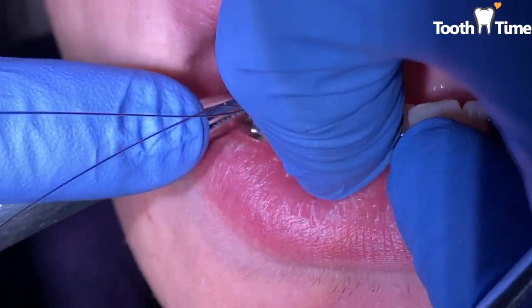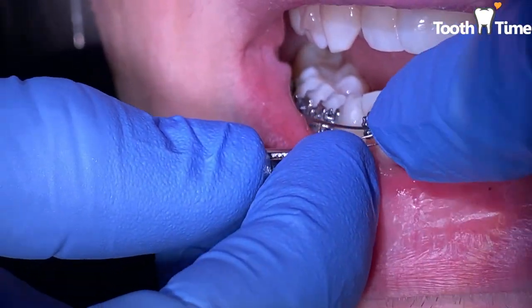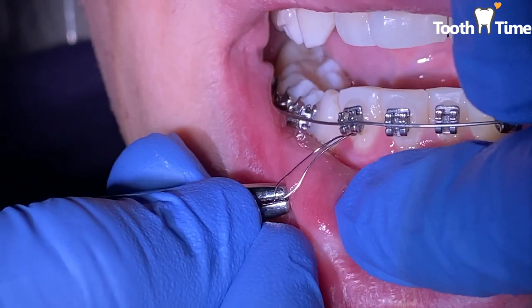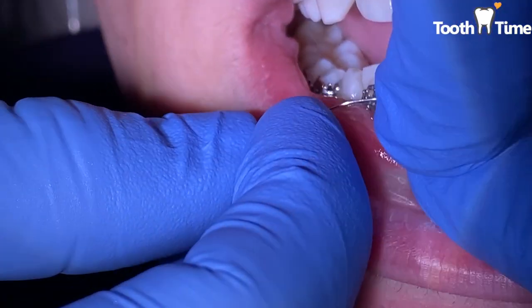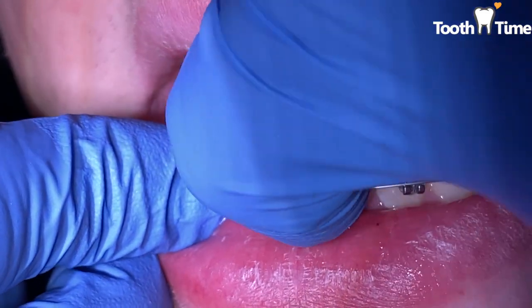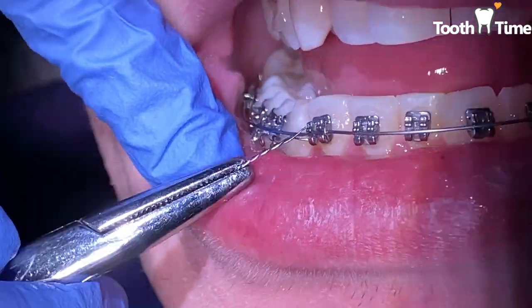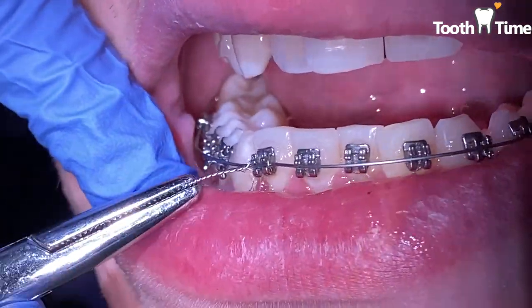Also, because you are in clear aligners, you have to make sure that you clean the clear trays. You can get a separate toothbrush, use some soap water, or you can use another toothbrush with some toothpaste and just kind of clean any of the plaque or bacteria that builds up on the tray so it doesn't sit back on your teeth and can cause some cavities.